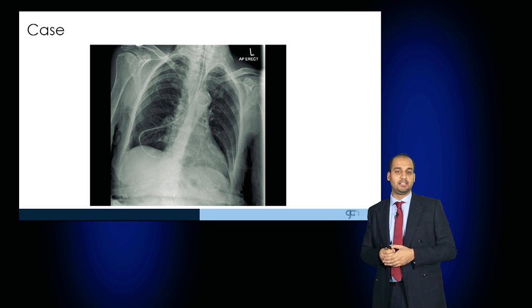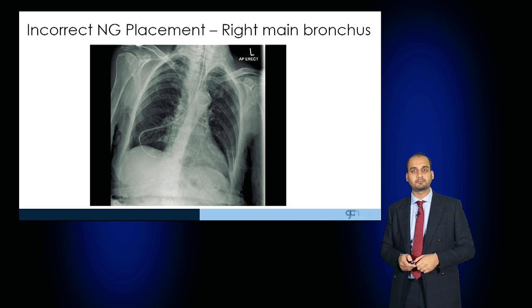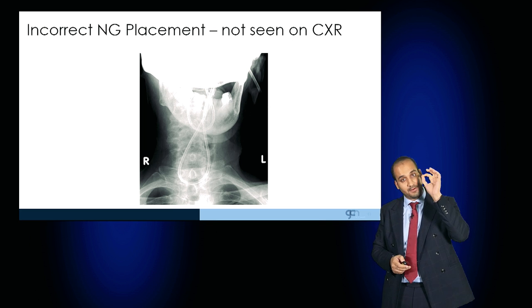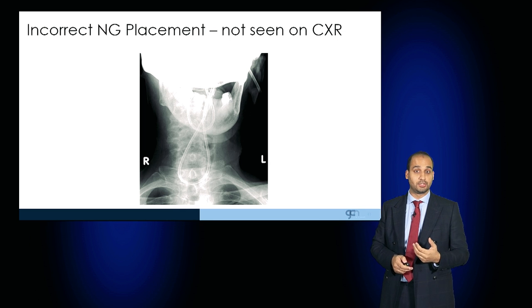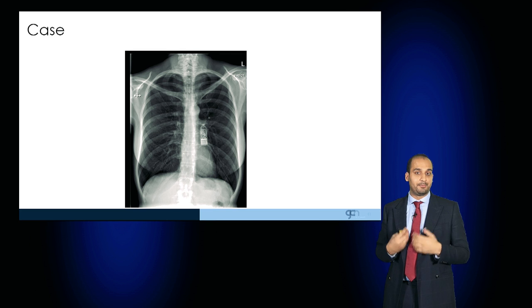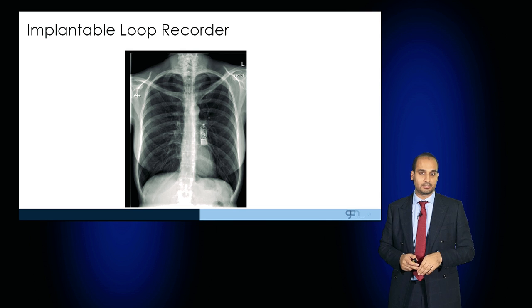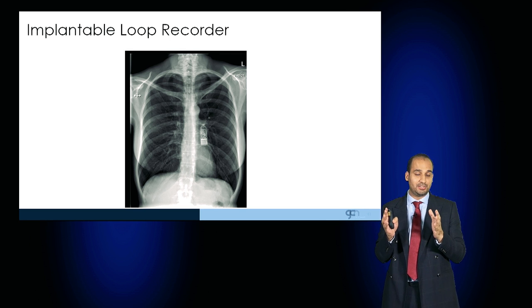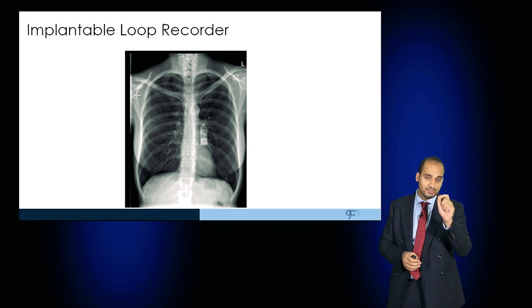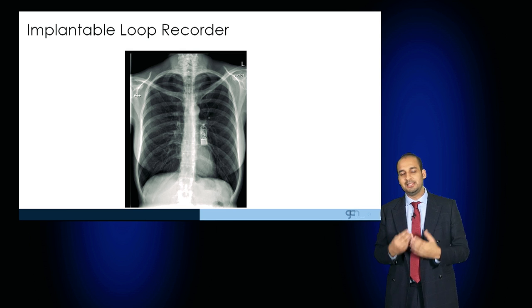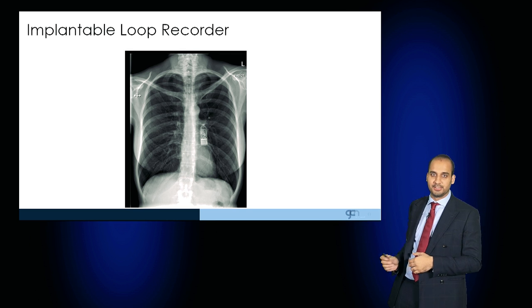Incidentally, you can see this patient has age-related aortic calcification. This is an NG tube that had curled up in the oropharynx — sometimes this does happen when it's very difficult to pass through, and that can't be used either. This is an interesting foreign body that looks like a USB pen in the breast pocket, but actually this is what an implantable loop recorder device looks like on a radiograph. This device is implanted in the patient and records the beat-to-beat ECG tracing for a very long period of time — for months on end — allowing you to determine whether there are subtle arrhythmias. It is particularly useful when investigating patients with cryptogenic strokes.